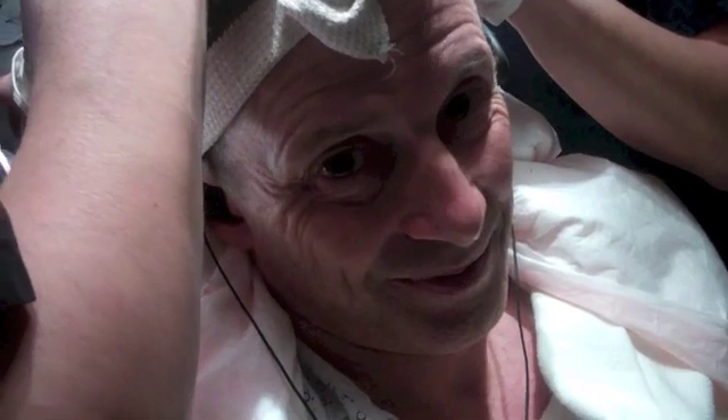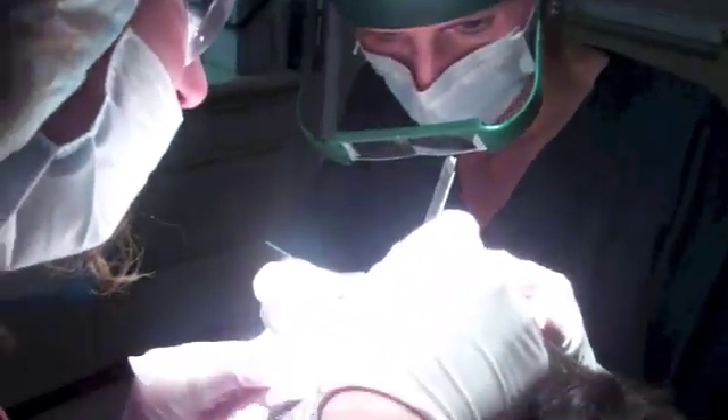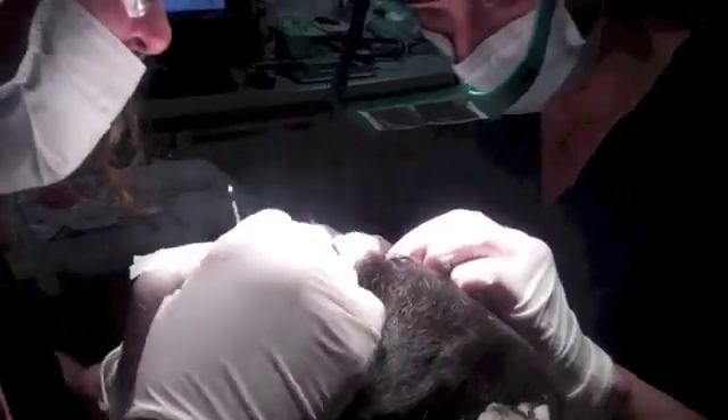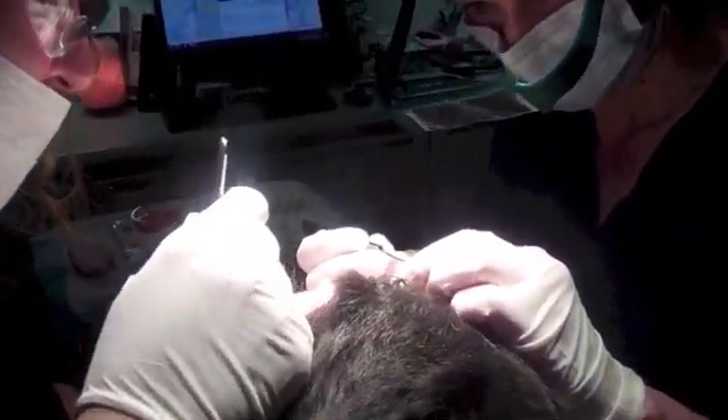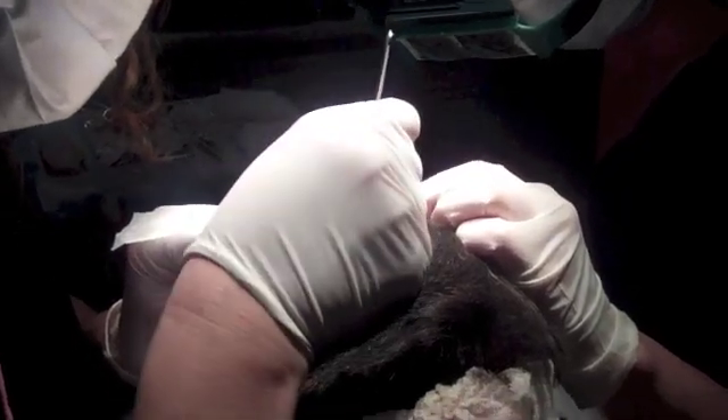What are you watching now, Clay? I've got 30 Rock on right now. Just to let you know, we do have a huge HD screen he's not using, but that's okay. This is very convenient because I can set up what I want to watch at any time. We're doing the graft placement right now — taking the grafts that have been beautifully dissected, cleaned up a little from what the robot did, and placing them into the site.